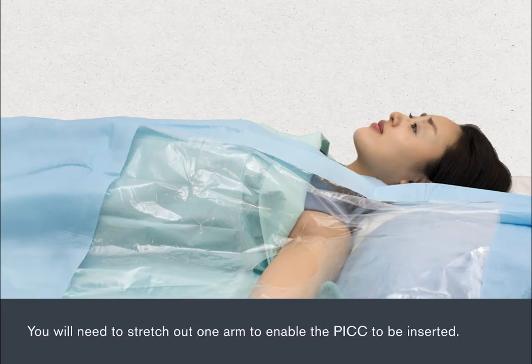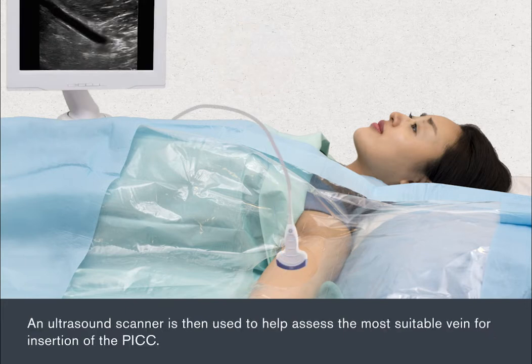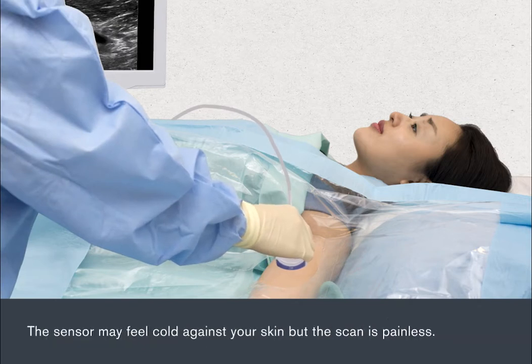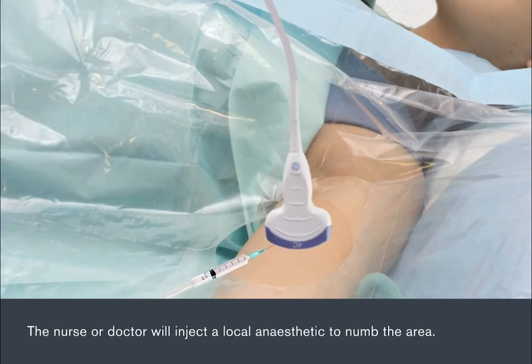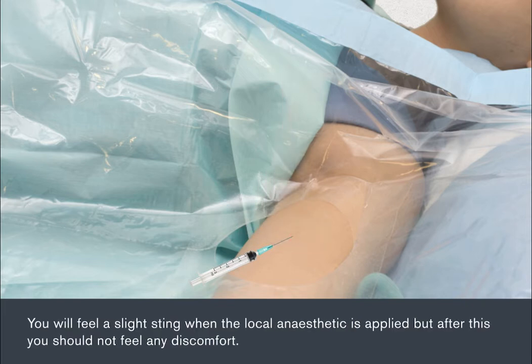You'll need to stretch out one arm to enable the PICC to be inserted. The nurse or doctor will clean the area where the PICC line is to be inserted. An ultrasound scanner is then used to help assess the most suitable vein for insertion of the PICC. The sensor may feel cold against your skin, but the scan is painless. The nurse or doctor will inject a local anaesthetic to numb the area. You'll feel a slight sting when the local anaesthetic is applied, but after this, you shouldn't feel any discomfort.